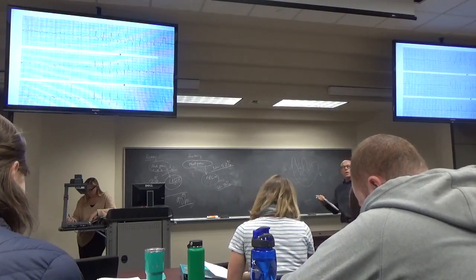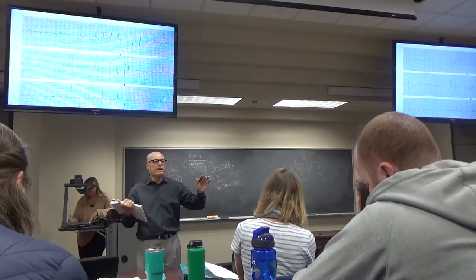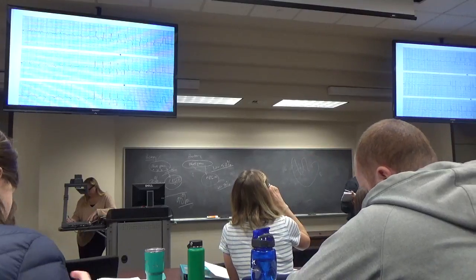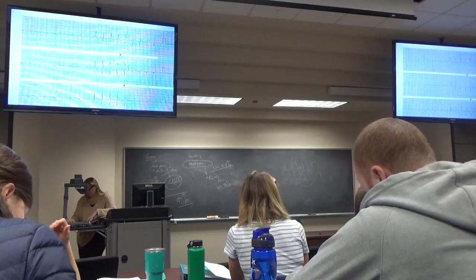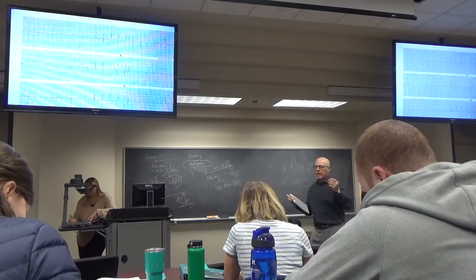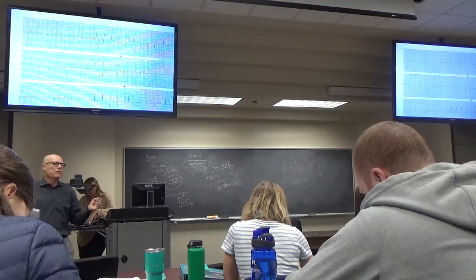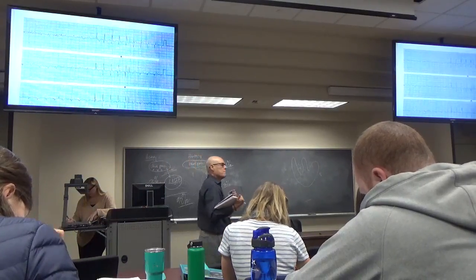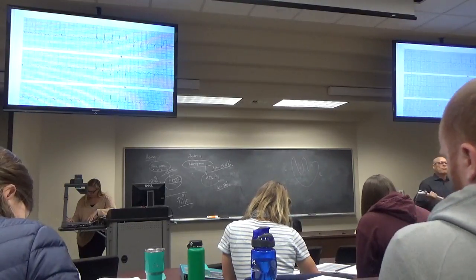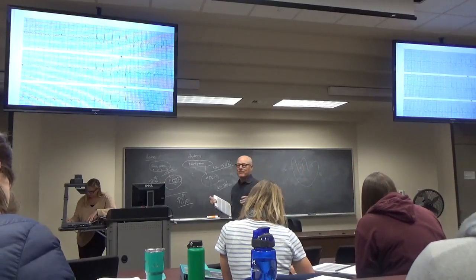Now, if we're going to think that this is atrial flutter, what does the rate have to be a multiple of? 300. And 125 and 130 are not multiples. So remember what I said. You need to really worry about it if it's 150. That's a 2-to-1 block in atrial flutter. You can get a rate of 150 in a sinus rhythm, if you're exercising really hard, or someone's infusing epinephrine into your vein. But it's not common. If it's 150, it's much more likely to be atrial flutter with a 2-to-1 block. But 125 and 130, you're never going to be atrial flutter with a 2-to-1 block, because they're not multiples of 300.